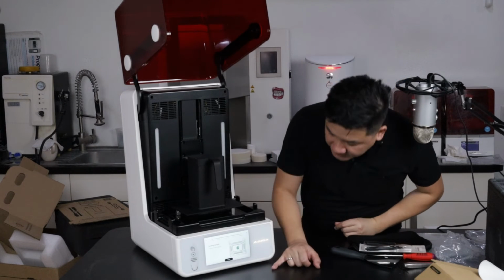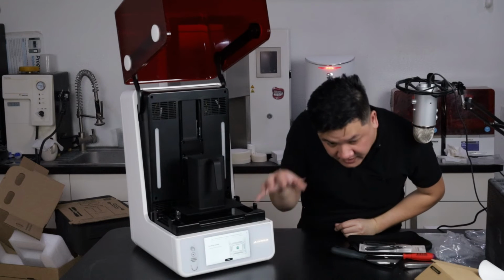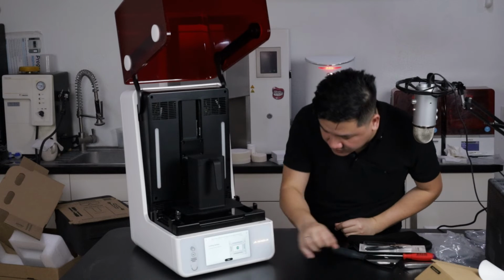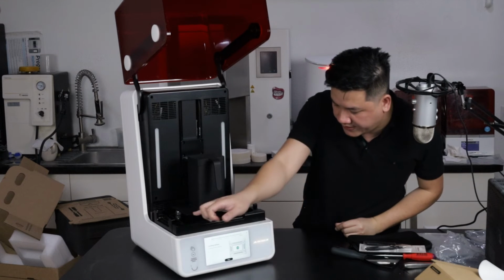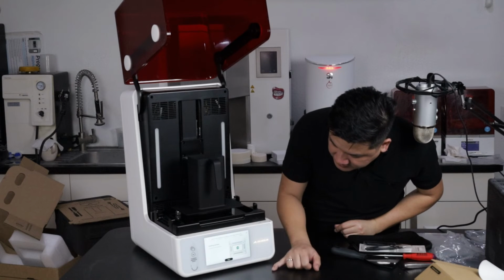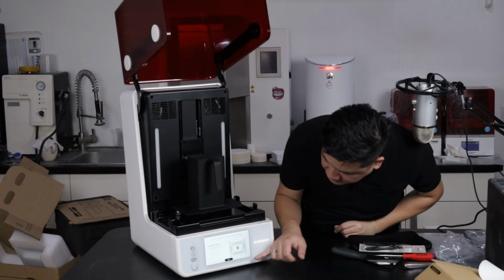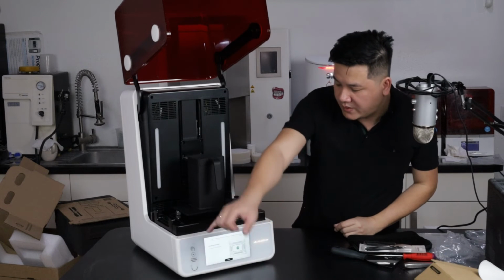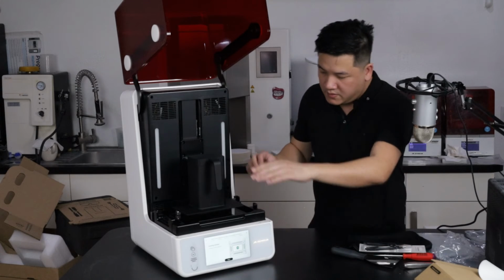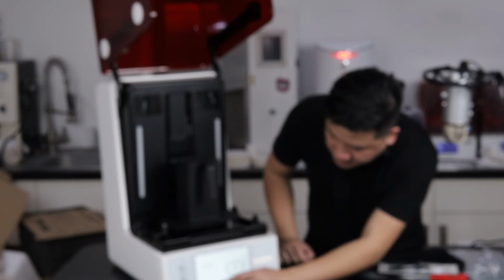So the mean deviation here is, this corner is 0. Obviously it always tells you what the lowest one and which one the highest one is. It was 50 microns on this front left corner here, and on these two sides here this was less than 1 micron, and this was less than 8 microns there. So 8 microns and that one's 50. So wow, that's really good straight out of the box. You don't have to do anything.